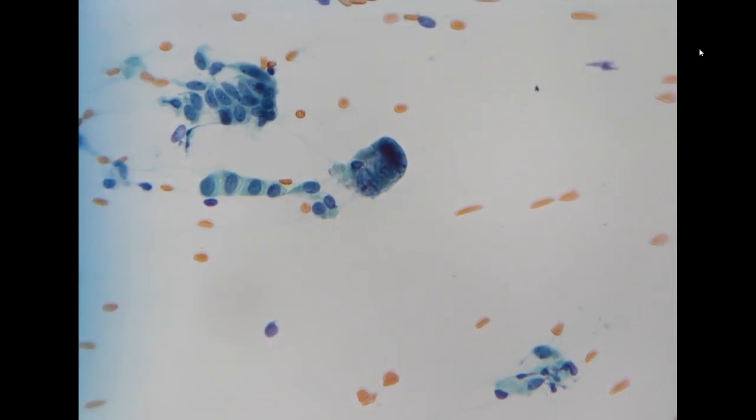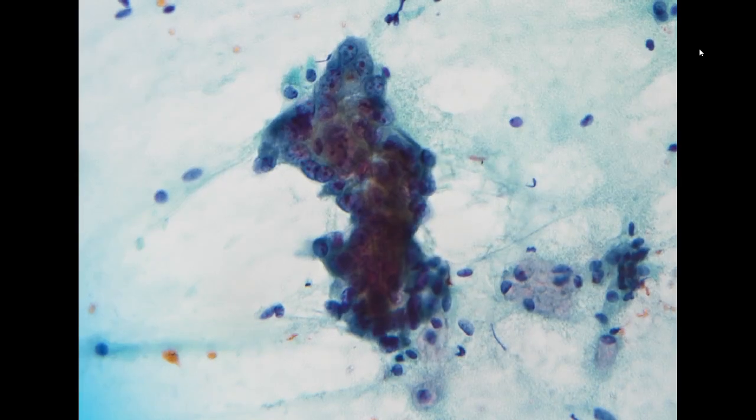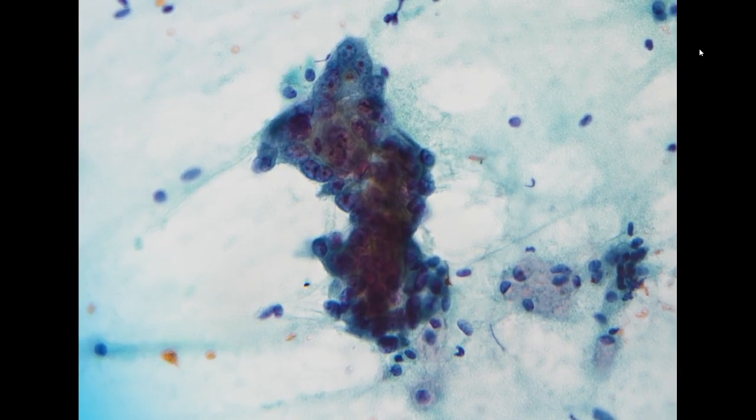This actually looks like adenocarcinoma. This one is even more obvious. If you see something like this in other places, you would call this adenocarcinoma. So this is a very typical extrauterine adenocarcinoma pattern.